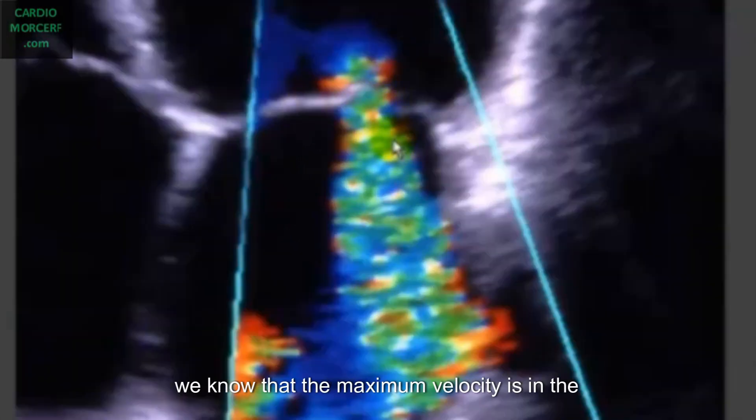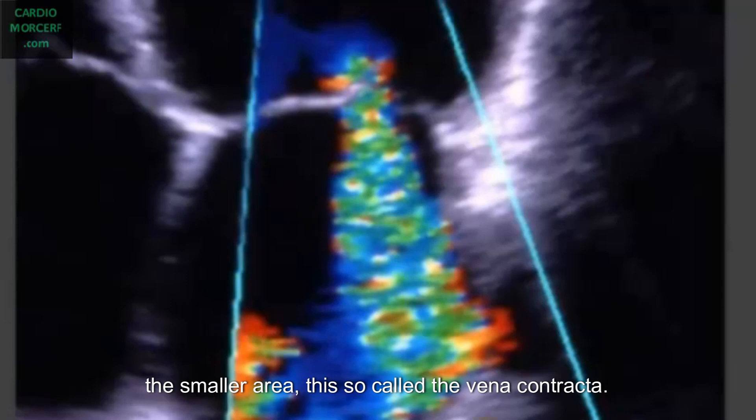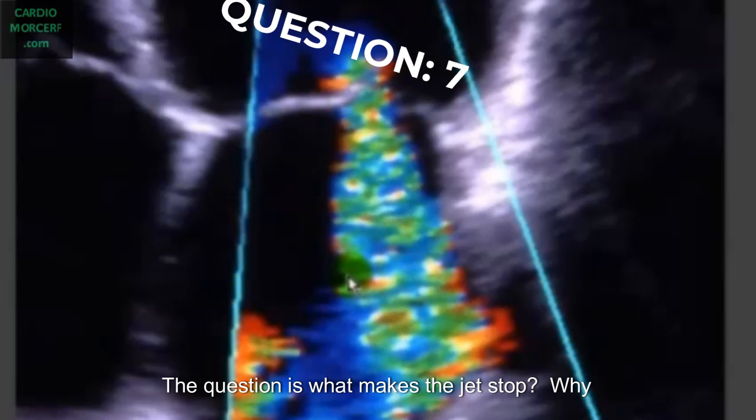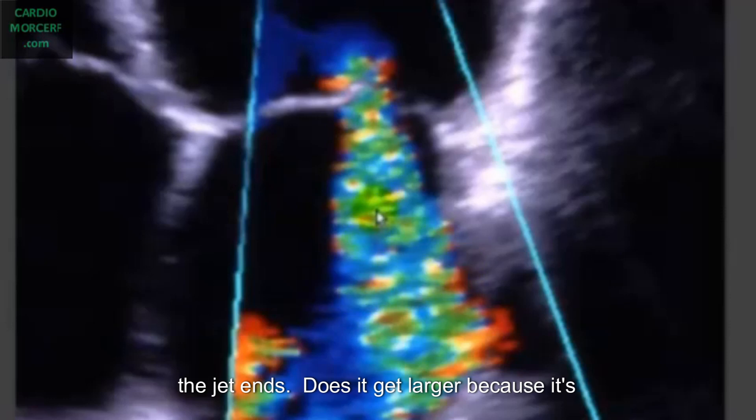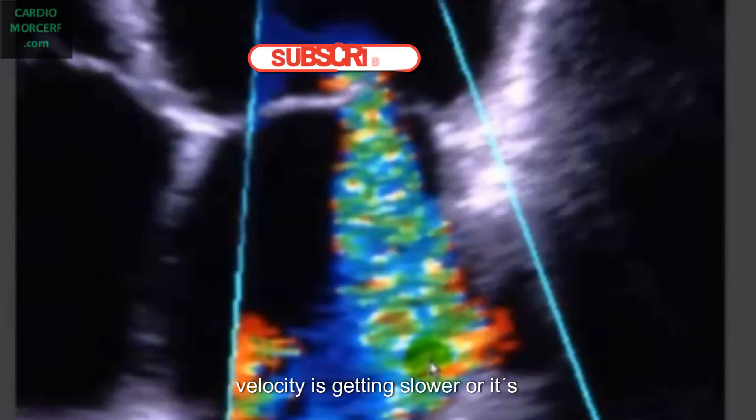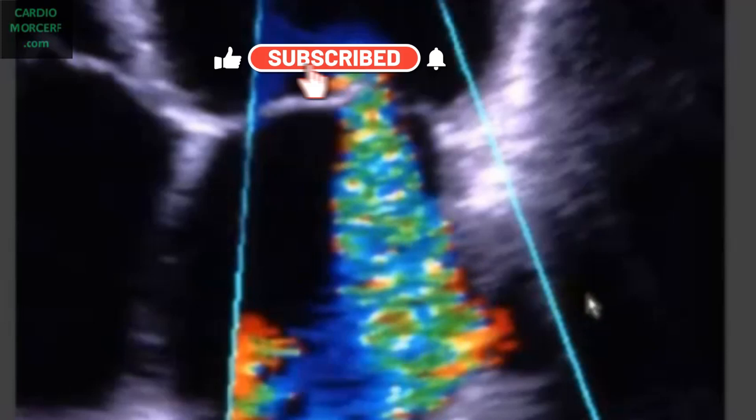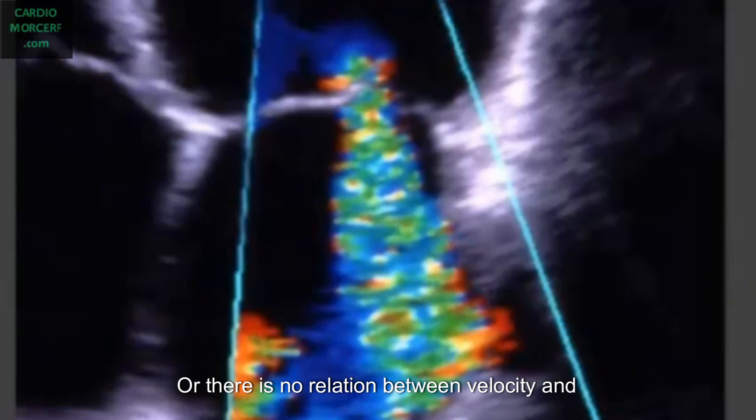Then when we see a jet like the mitral regurgitation, we know that the maximal velocity is in the area of maximal obstruction, where it has the smaller area, the so-called vena contracta. The question is, what makes the jet stop? Why is it getting larger after the obstruction until its velocity returns to normal and the jet ends? Does it get larger because its velocity is getting slower? Or it gets slower because it gets larger? Or there is no relation between velocity and width of the jet.